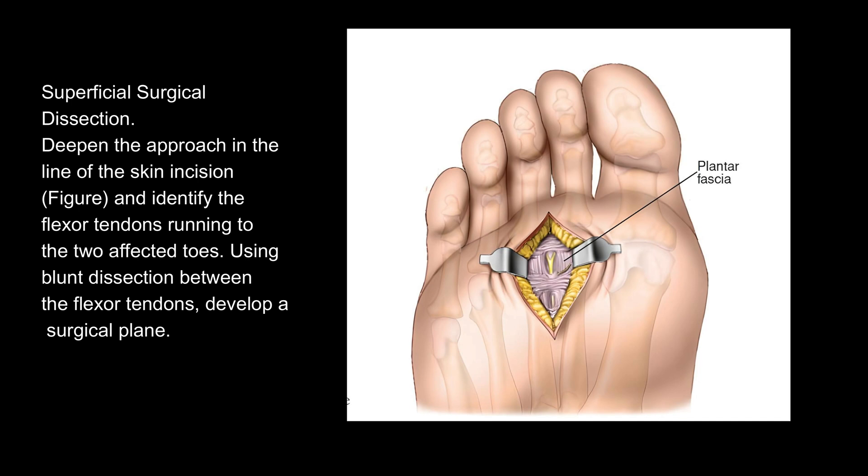Begin the incision just distal to the level of the metatarsophalangeal joint and proceed proximally. Superficial surgical dissection: Deepen the approach in the line of the skin incision and identify the flexor tendons running to the two affected toes. Using blunt dissection between the flexor tendons, develop a surgical plane.